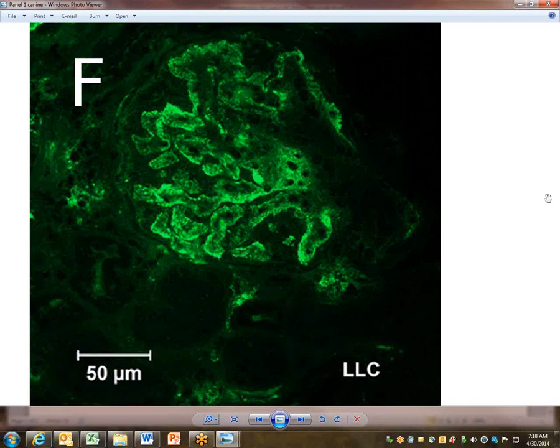Yeah, I have trouble reading IF, but I called it just positive. I think the staining is highlighting the glomerular tuft pretty specifically. That's true, but importantly, it's not just green. You get a sense of granularity, and it is the capillary. IF is always hard to photograph well.